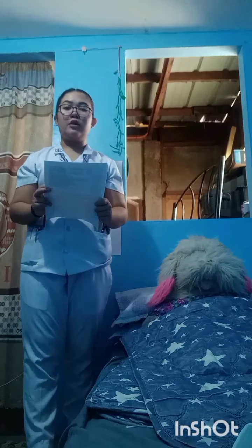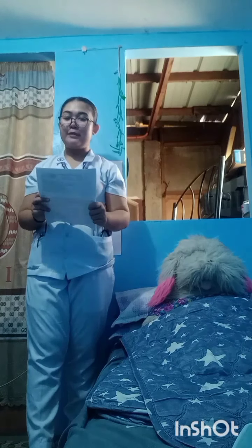For the doctor's order, we have here in room 203, our patient named Melanie Go, 36 years old, and the doctor's order is here: administer oxygen therapy, oxygen via nasal cannula. So we determine what therapy we're going to give our patient.